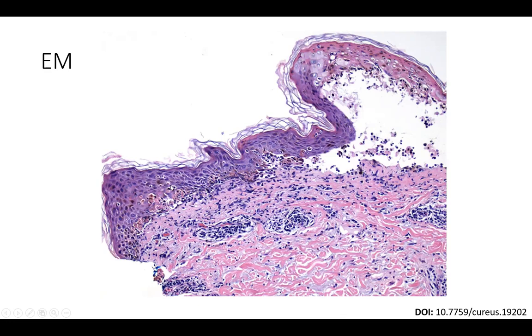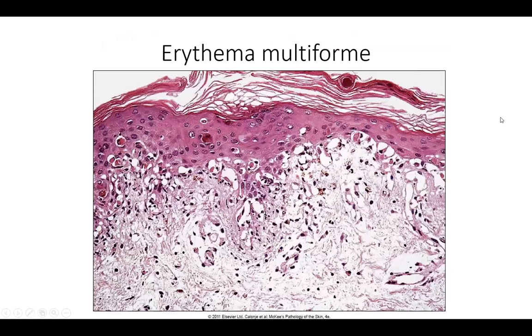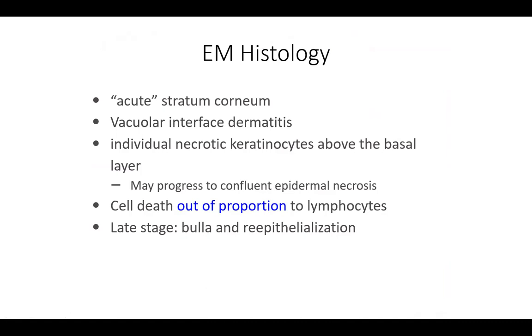To summarize erythema multiforme: look for the acute stratum corneum preserving basket-weave orthokeratosis, vacuolar interface dermatitis, and individual necrotic keratinocytes above the basal layer, which may progress to confluent epidermal necrosis especially in the dusky center. Cell death is typically out of proportion to lymphocytes. In late stage, you can have bullae or re-epithelialization if the bulla has ruptured.